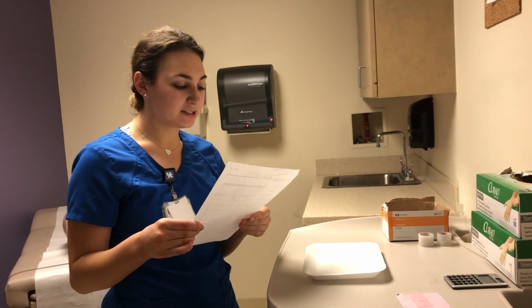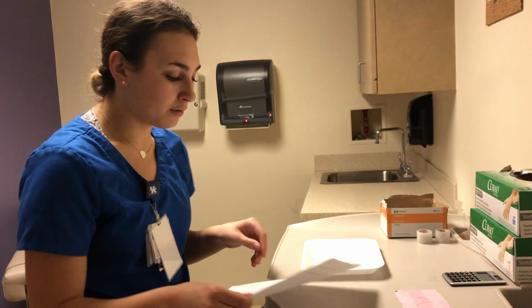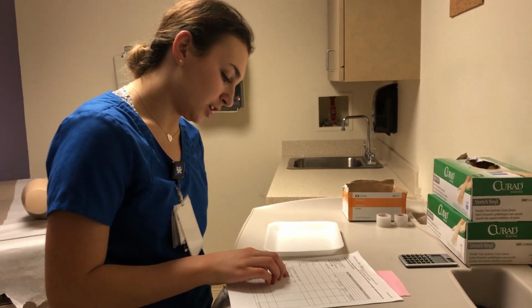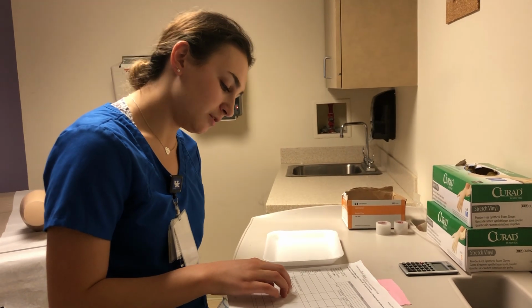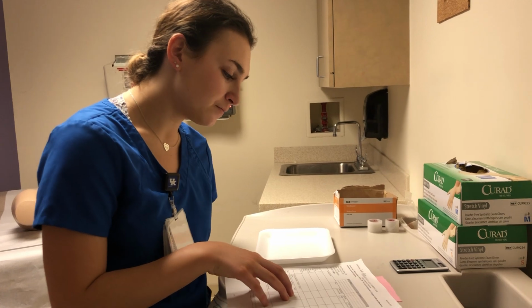The only allergy is Demerol. Today's date is February 10th of 2020. I will be administering a regular insulin injection. The concentration is 100 units per 1 milliliter. We'll be administering it subcutaneously to the abdomen.